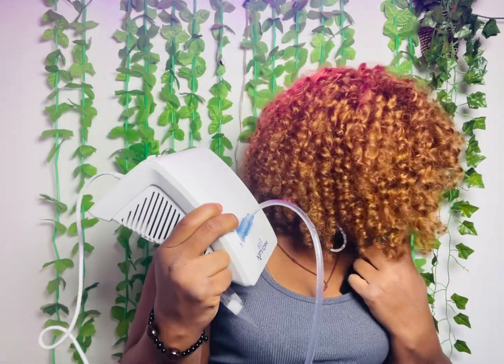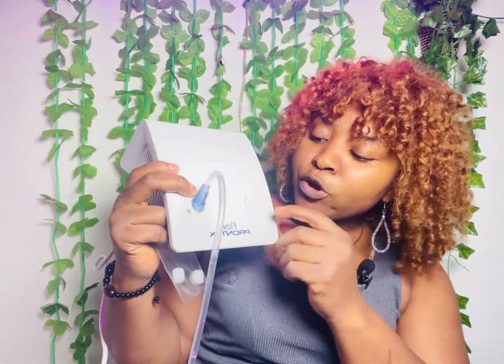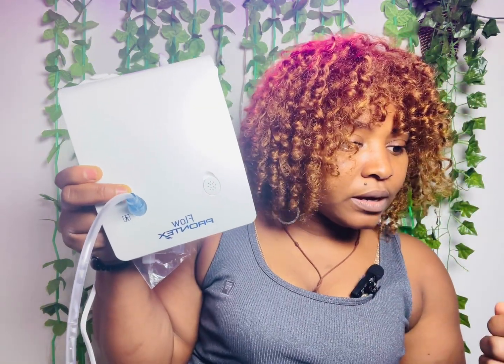So if I'm supposed to open it, I don't know if there's anything close by I can easily open this with. No, there's not. But just know that when you open this place, use something sharp, maybe a knife or scissors, with a sharp edge that you can actually open this with. Open it.